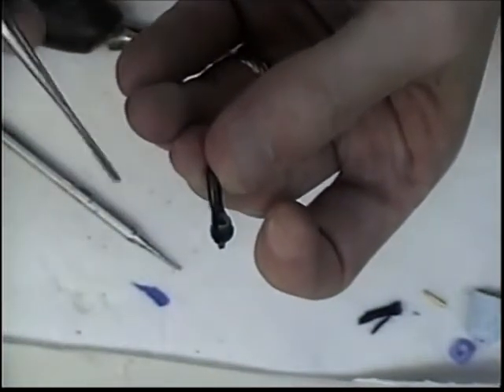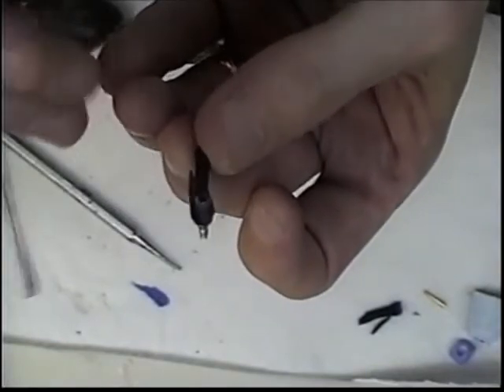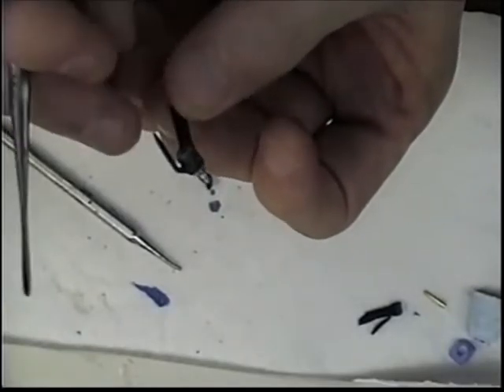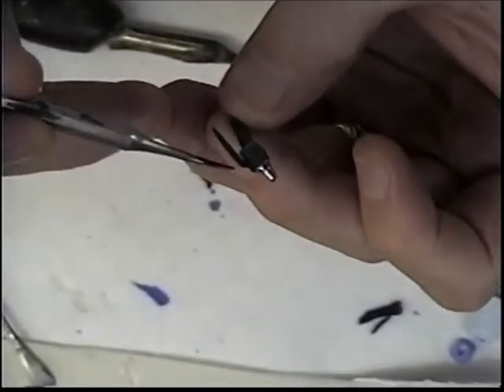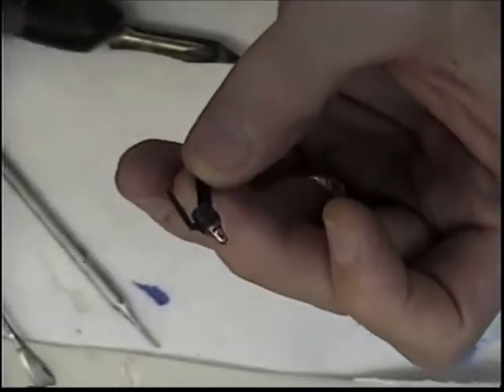I want to make sure that the hole has access for investment and that this little reservoir is not in the way. Sometimes when you bend it, it will crack a little bit. That looks good.